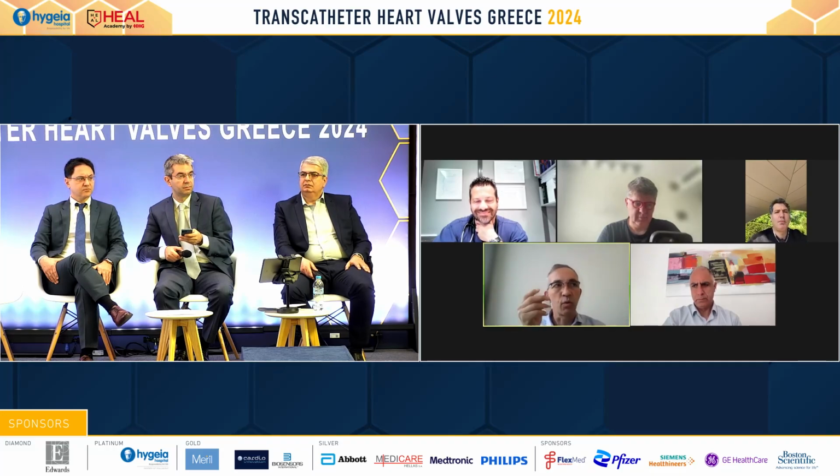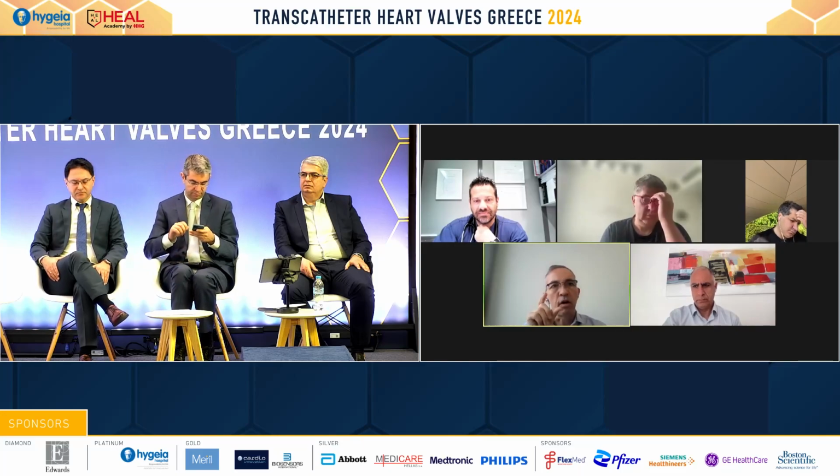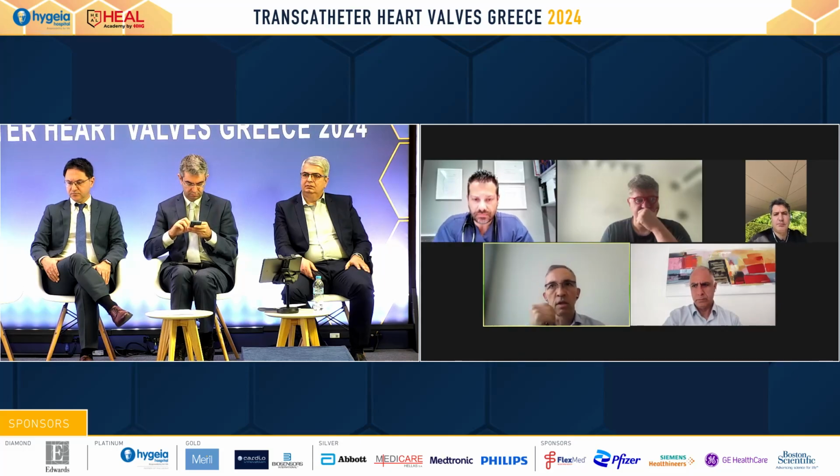The other end of the spectrum, what we were calling, in the early days of TAVI, the cohort C, are the patients where maybe the heart failure is too advanced and probably the TEER will be futile, because it's a procedure that has a cost in terms of paying the device and healthcare resources, and if it's futile for the patient, then it's a waste of time, money and resources, and taking a risk for the patient.